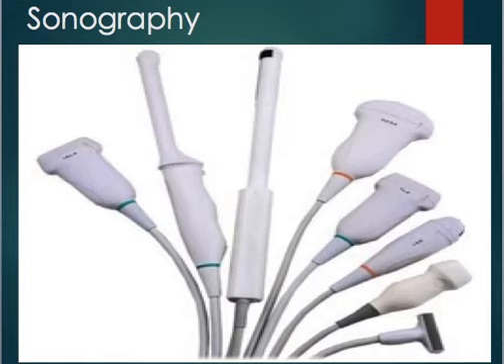So the footprint on the transducer is what's touching the skin. There are larger footprints, and then smaller footprints, so you can see the difference there. The larger footprint is more expansive and has a bigger viewing area. And the smaller footprint obviously has a smaller viewing area, but it's good for in-between things such as ribs, the fontanelle on the skull, or cardiac ultrasound.